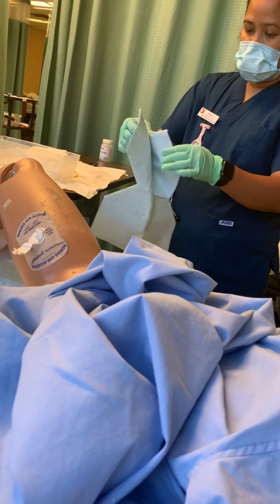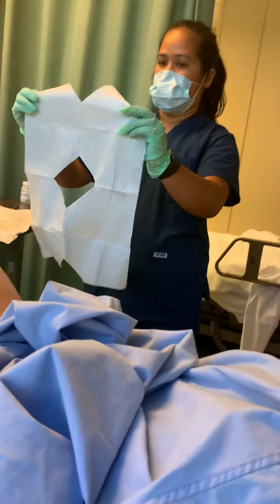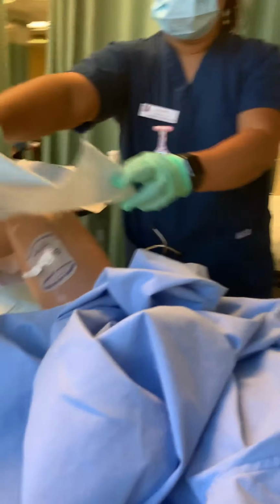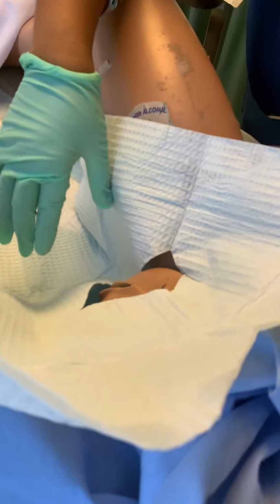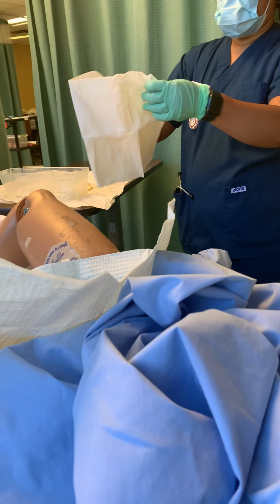So now this side is the shiny part. Do it like that. Drop it. If you want to fix it, just touch in the middle. Do not touch the 1 inch border. Okay. And this one too.